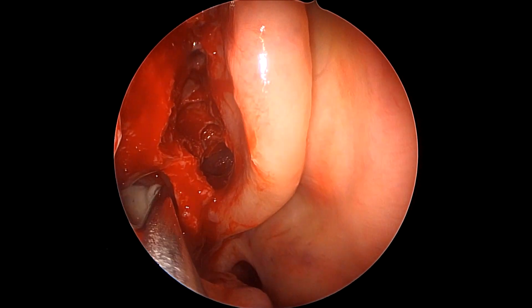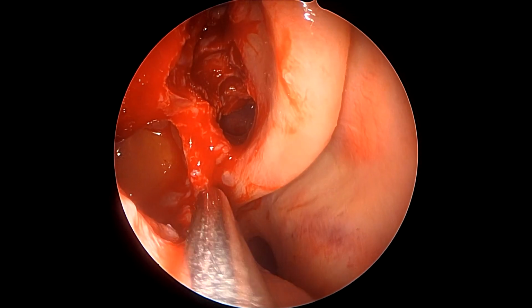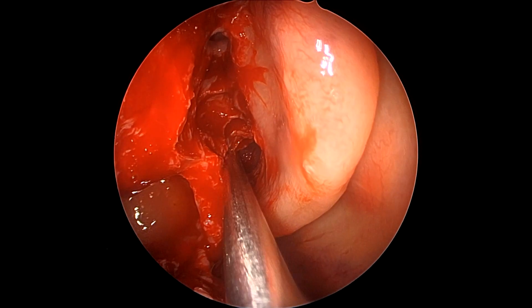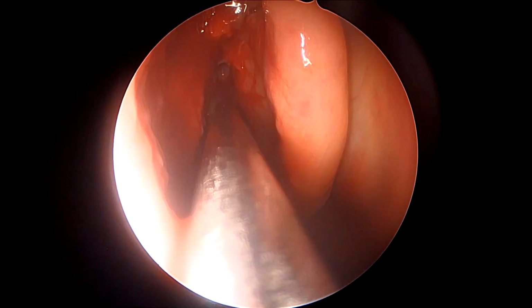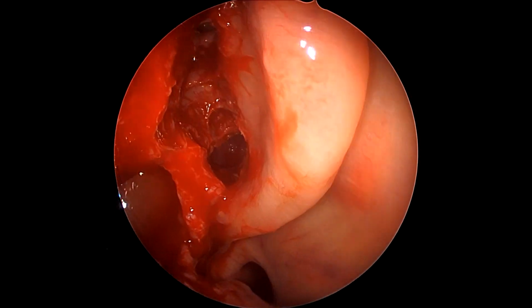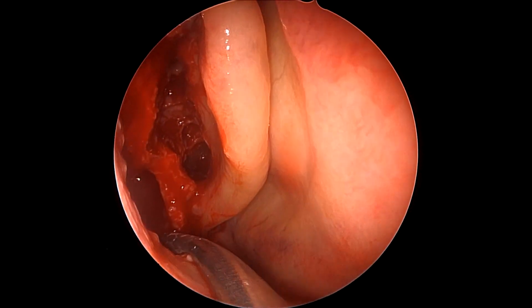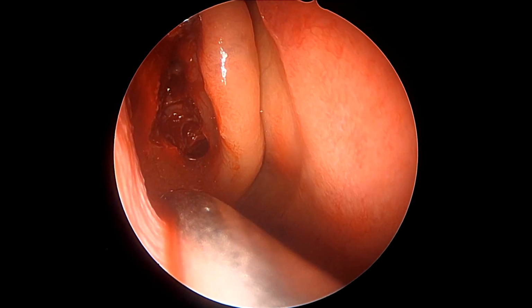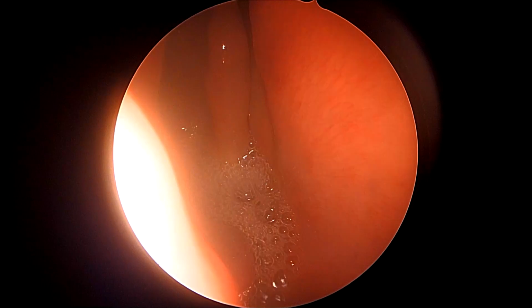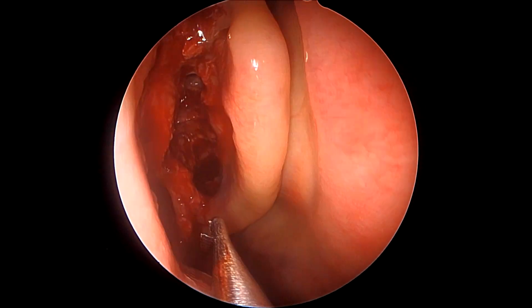Now we can see our most important landmarks, the antrostomy. We can see some pus and purulent secretions coming from the antrum, the posterior choana, how the sphenoid sinus is associated with the choana, and how the entire ethmoid septations can be dragged from posterior to anterior, from the sphenoid sinus towards the anterior ethmoidal sinus, and lastly towards the frontal recess or the frontal ostium as well.